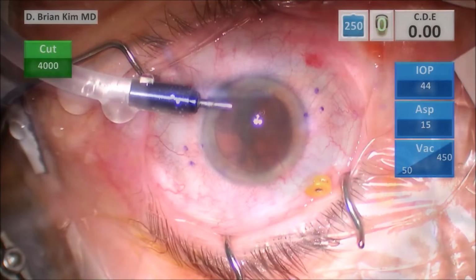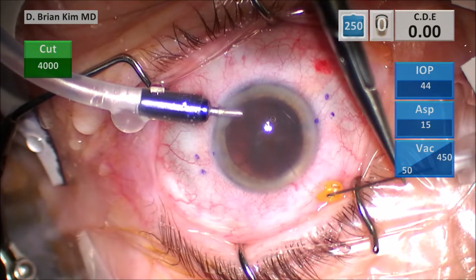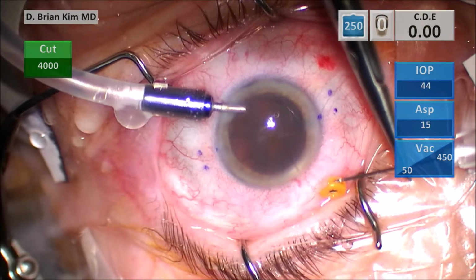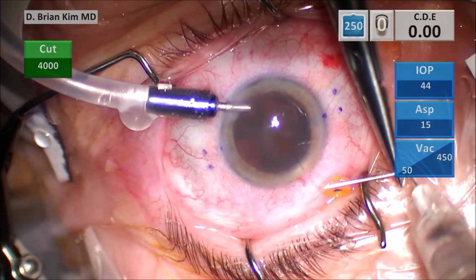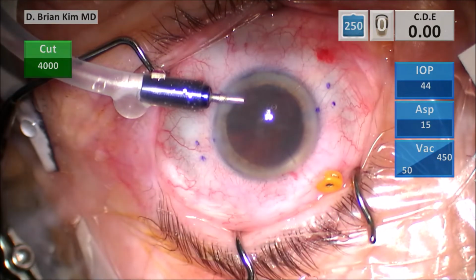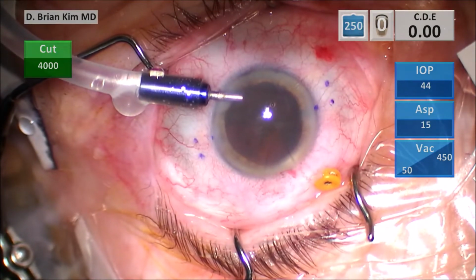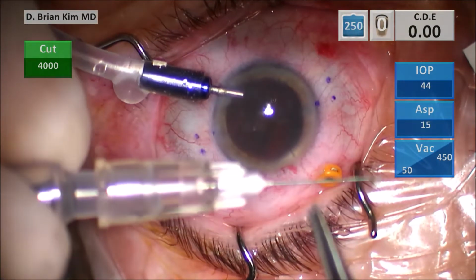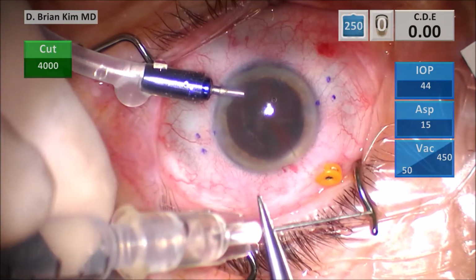And so now we're going to focus on our needles. This is the right side needle. I bend the needle about 9 millimeters from the tip, and I angle it about 70 degrees, but I make sure that the bevel faces towards me as the syringe is held up and down, because I'm going to hold the syringe like a pencil in my hand. And so I want to make sure that the bevel is facing towards me with the right hand.